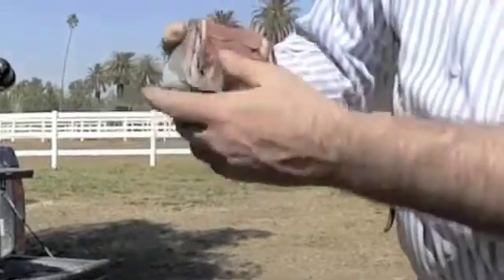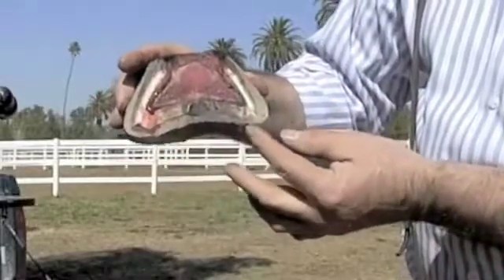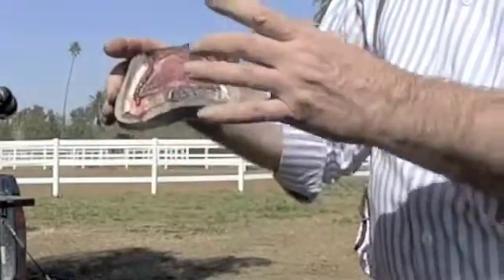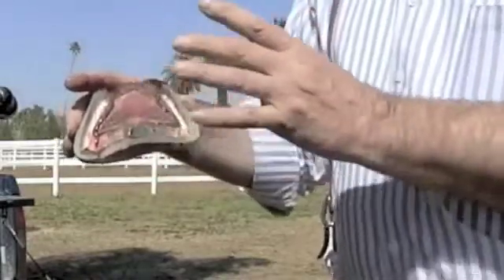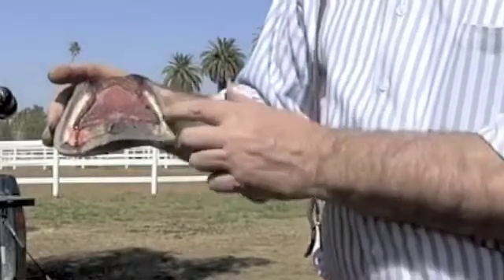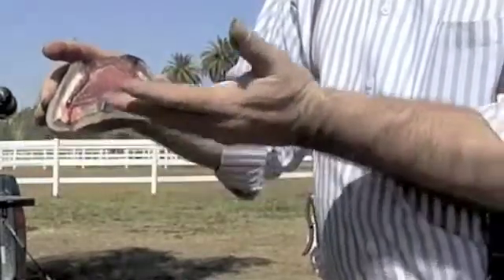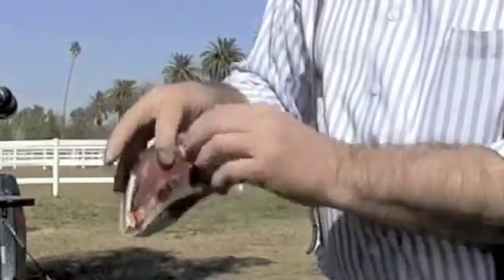We're able to create an extension that best matches the foot — adding some distal length brings the coffin bone better into balance. We saw all of this by looking at the hoof capsule, not just from radiographs. Trust me, radiographs would be great, but with good accurate observation of the hoof wall you'll be able to read that the collateral groove isn't in the center, the hoof is off to one side, the depth is different — and you'll know the coffin bone is sitting a little bit askew.